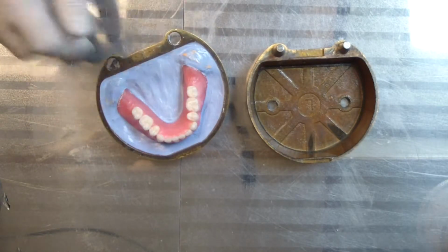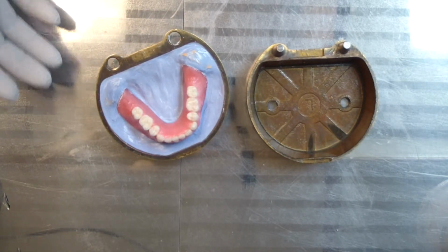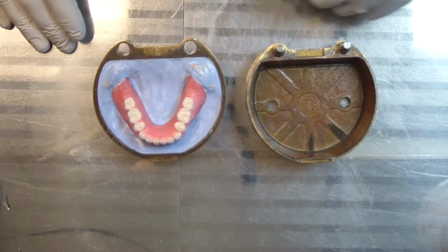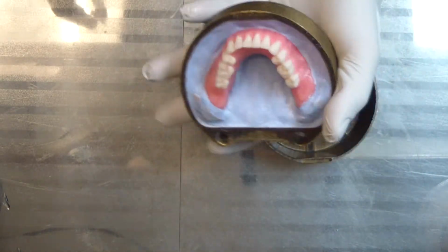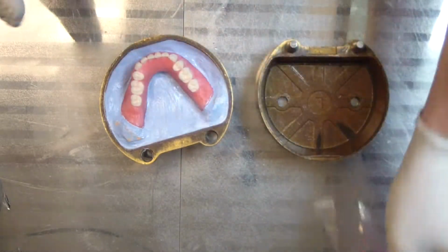You also want to have it dry, because if you have any water on there, it also makes the stone more fluid. You might trap some more air and stuff like that. So once I get to that point, what I do is I will take my surfactant or debubbleizer, and I'll just lightly spray the case. Not a lot. You don't want to pour it on there. You just want a very light coat of it.